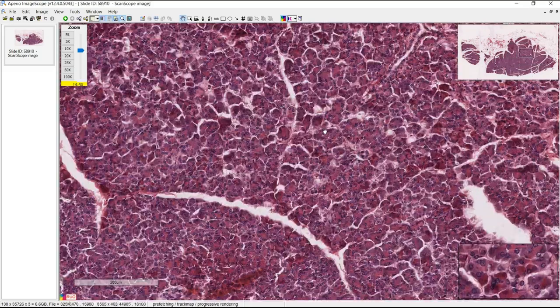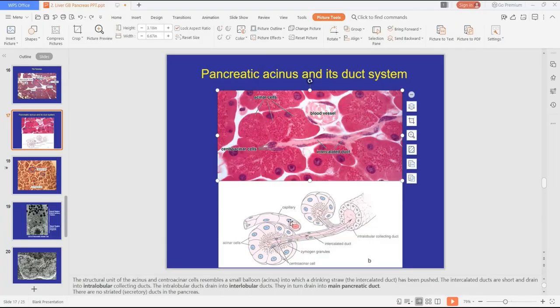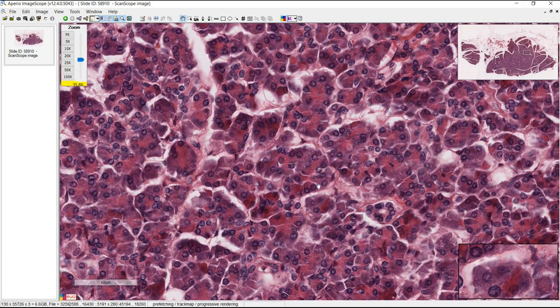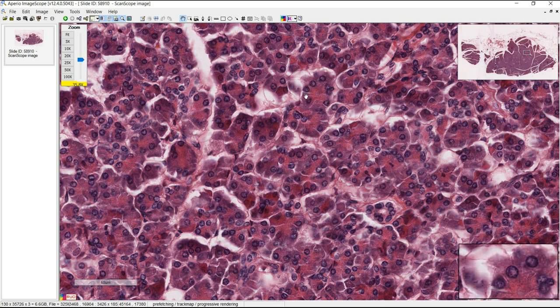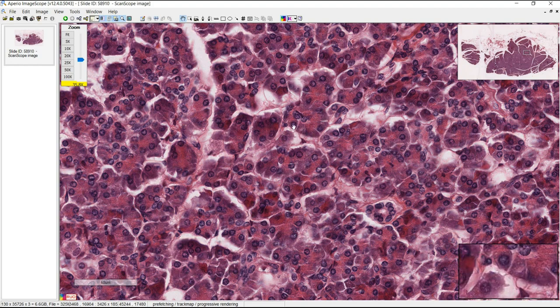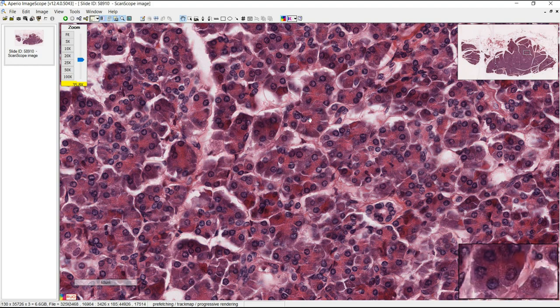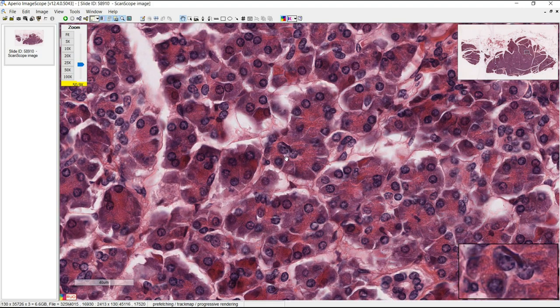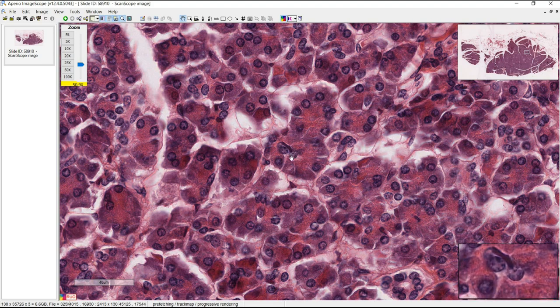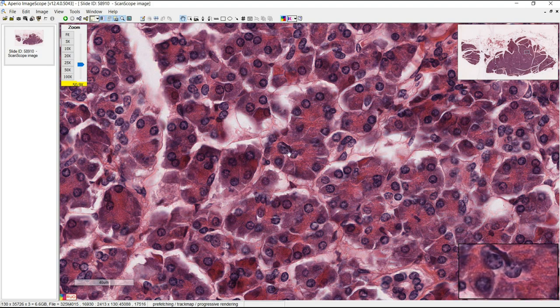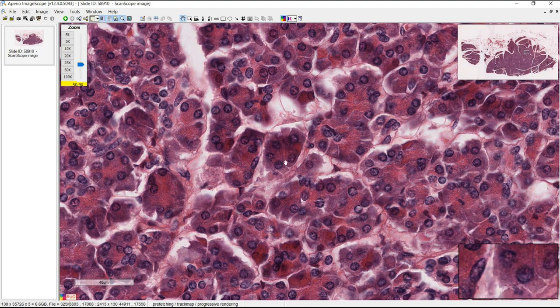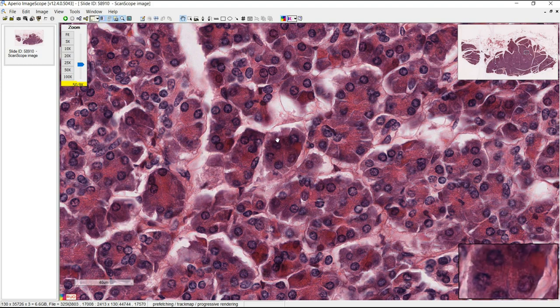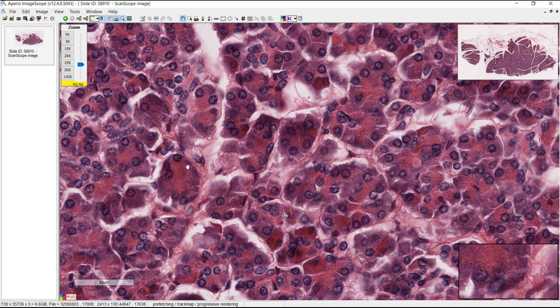On higher power, you can see the serous acini — these are pyramidal-shaped cells with a lot of cytoplasm and granules that are visible on this slide. Here's an example of one acinus, with the lumen in the middle. In the center of some acini, there's a lightly staining area with one or two central acinar cells. You won't see them for every acinus, since it depends on the plane of section.